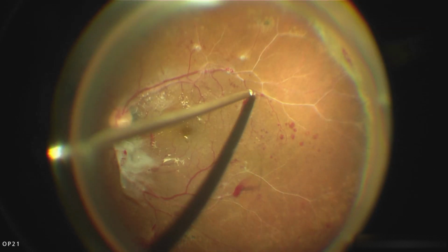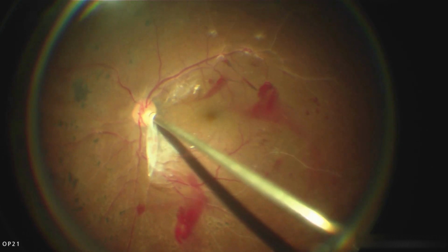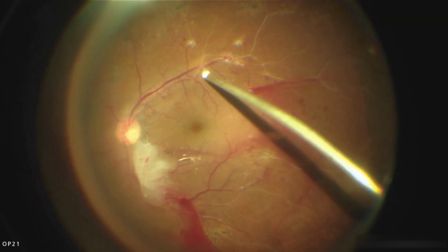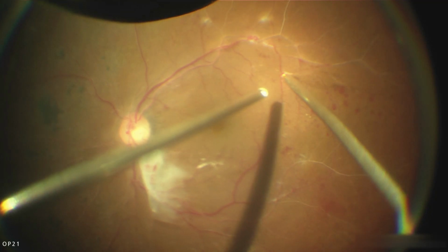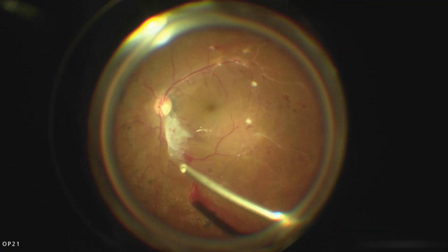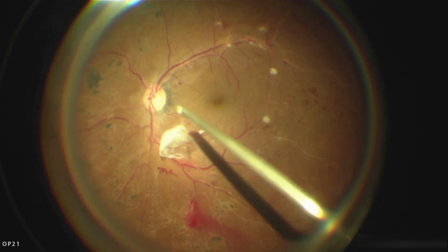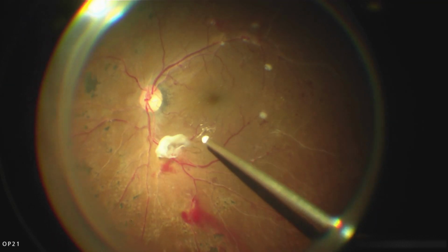Also, these epicenters need to be cut. One of my final procedures is to remove the tractions or the proliferations along the vascular arcades. So I start with the periphery and work my way in. There are obviously many ways to tackle this. One could start posteriorly and continue your way out as well.